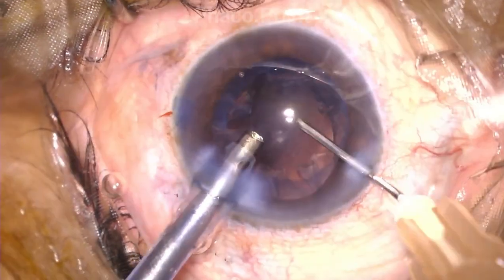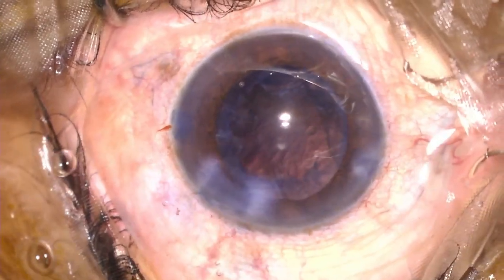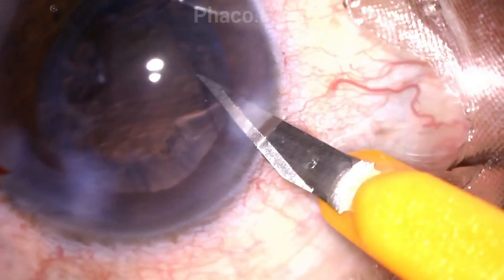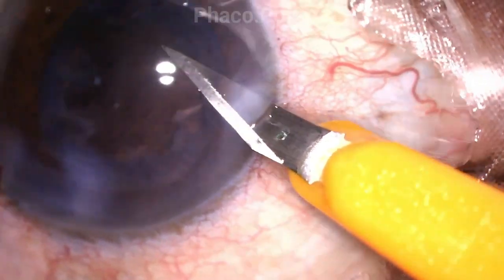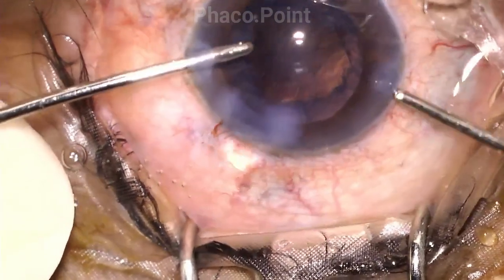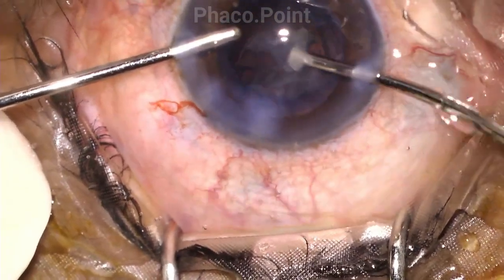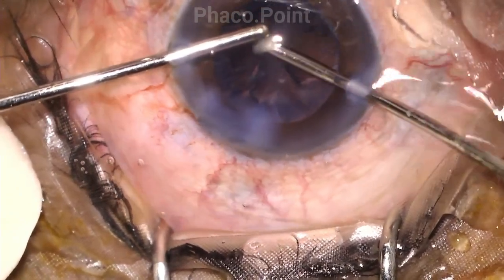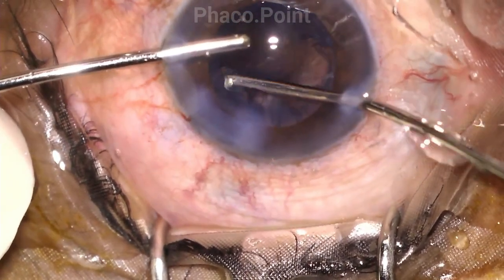Upon completion of nuclear emulsification and prior to irrigation aspiration, this is the point when we should enlarge the second paracentesis incision. The main advantage is that only at this point, when a slightly larger incision is required to allow introduction of the irrigation aspiration cannulas, do we enlarge it. By varying the size of the second side port incision during different steps of the surgery, you are able to achieve optimal stability of the anterior chamber.